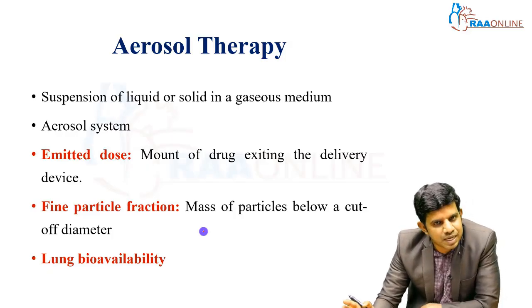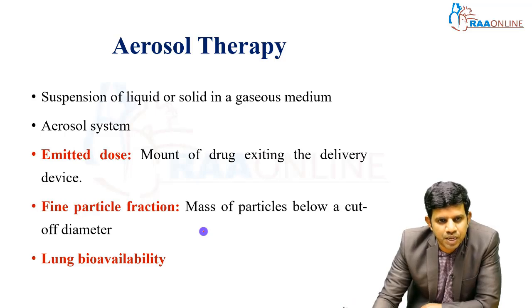So first, what is aerosol therapy? What are aerosols? Aerosols mean a suspension of liquid or solid in a gaseous medium. To deliver the aerosols, we need an aerosol system. It includes aerosol generators like nebulizers or MDI. Then sometimes we need additional equipment like spacers and so on.